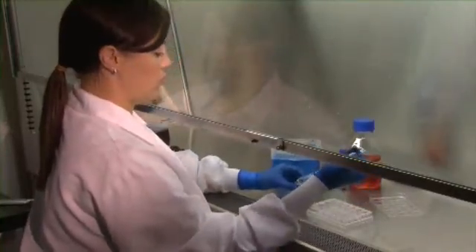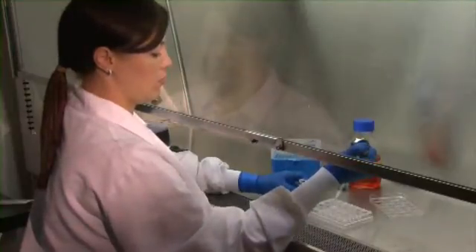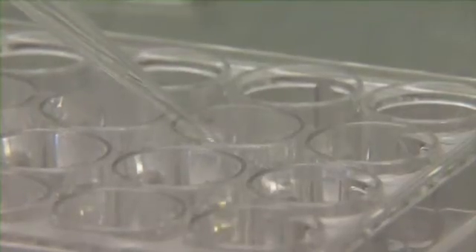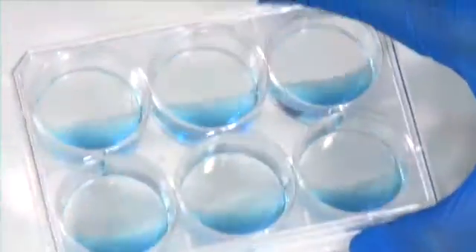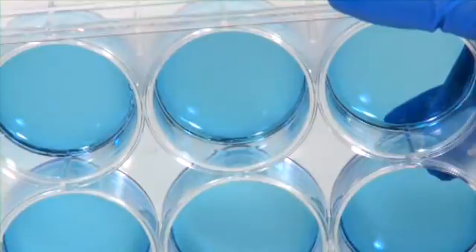Step 3: During this time, while the hydrogel is still liquid, you have a couple of options. First, you can simply pipette the liquid hydrogel into a plate to make a gel bed for 2D cell culture. Alternatively, you can mix cells into the hydrogel while still liquid and easily prepare a 3D cell culture. Let the hydrogel sit until full gelation has occurred.